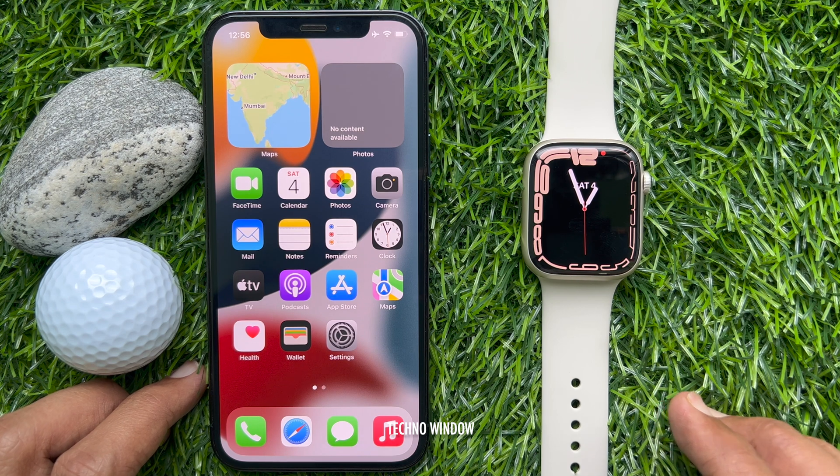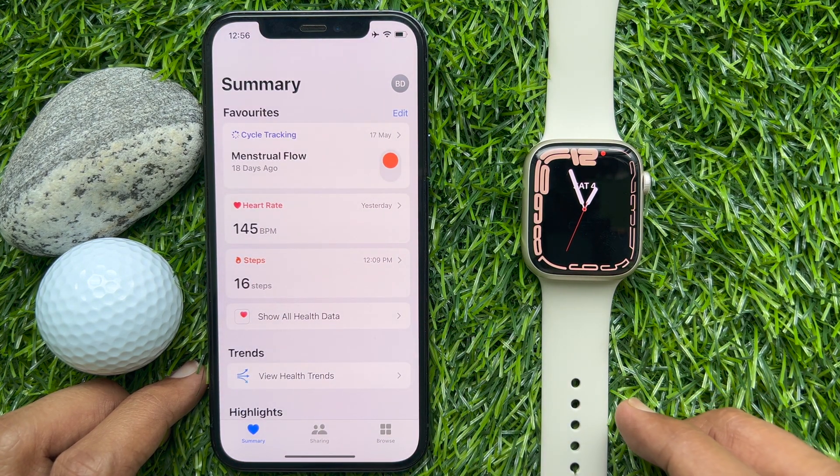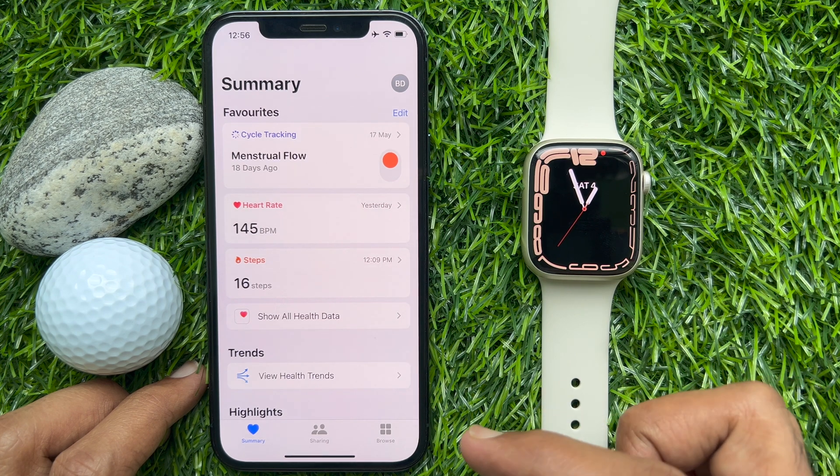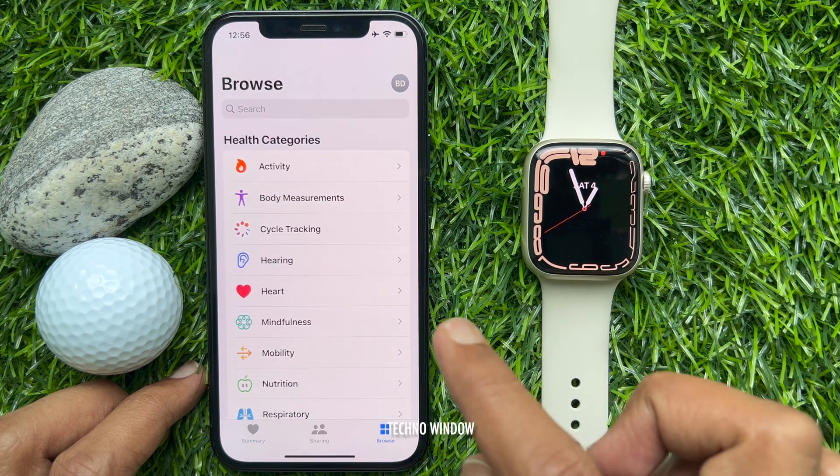First, open the Health app on your iPhone. Tap Browse on the bottom right. Then tap Heart.